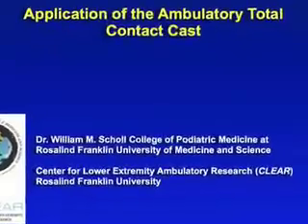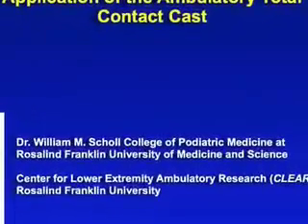We will now discuss the application of the Ambulatory Total Contact Cast. We initially begin by hydrating the leg for about five minutes prior to applying a very light dressing to the wound, which is typically just one layer to the area. You can see that very few materials are needed to apply the contact cast.